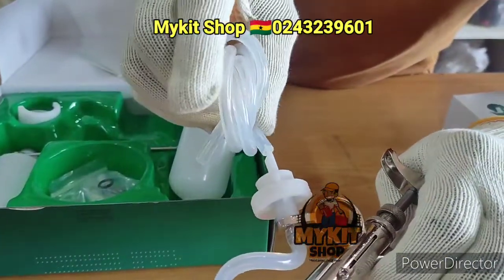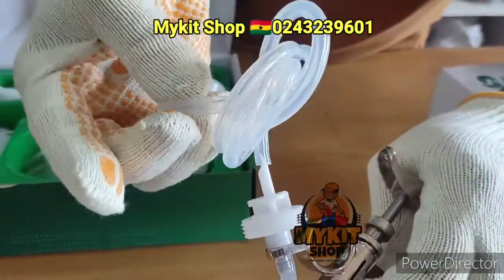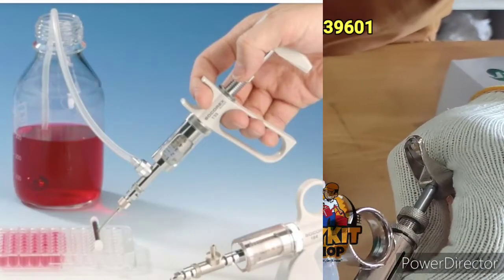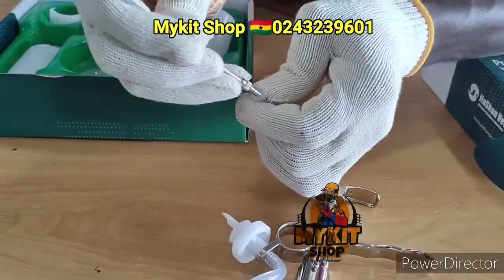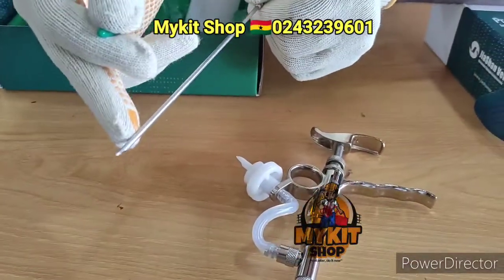Another way is to use the tube. You push the tube right here, and then the other end of the tube goes into your bottle. Alternatively, you can put this over here and the tip goes into your bottle.